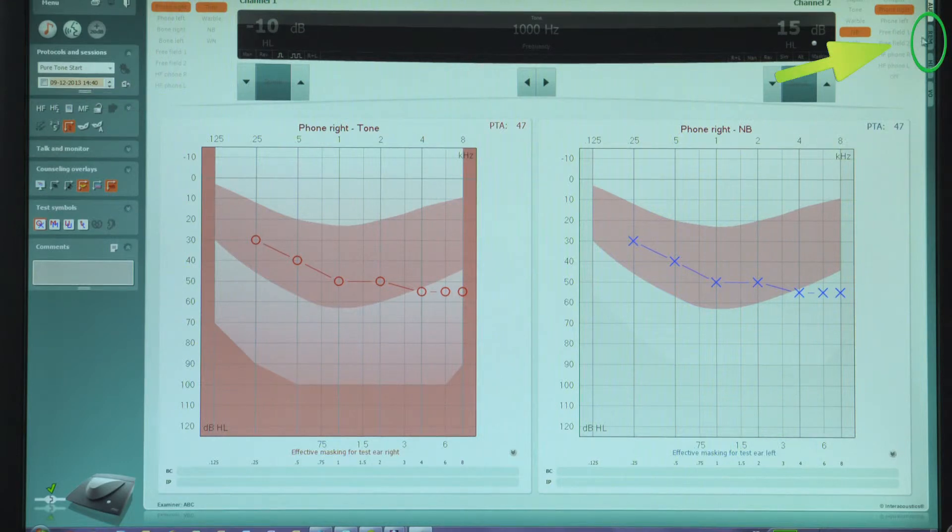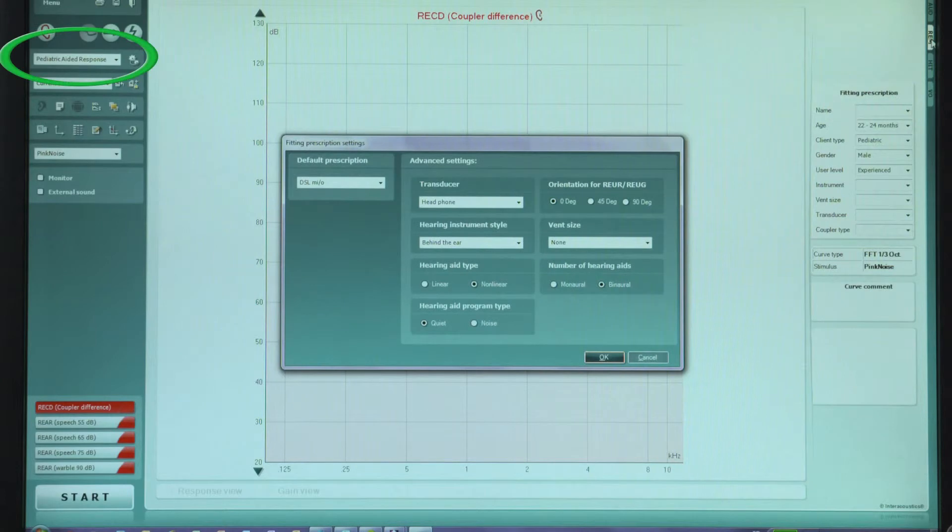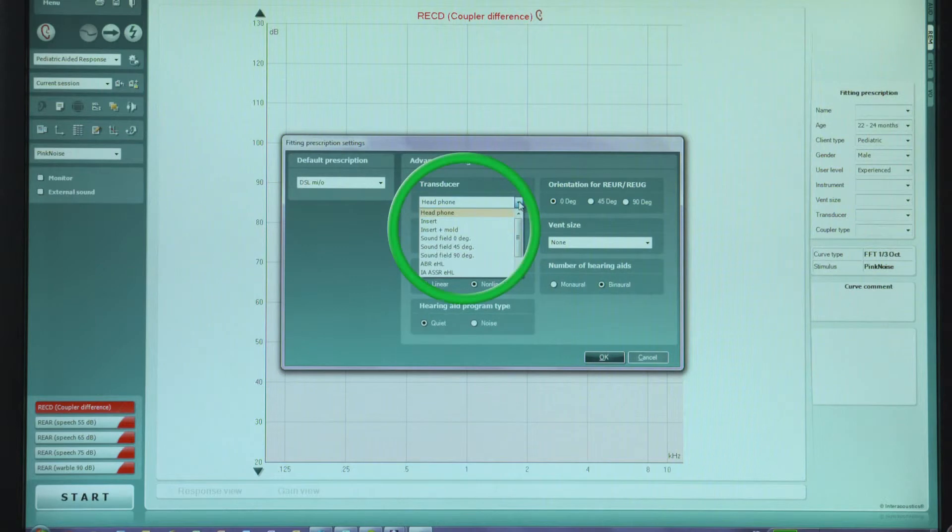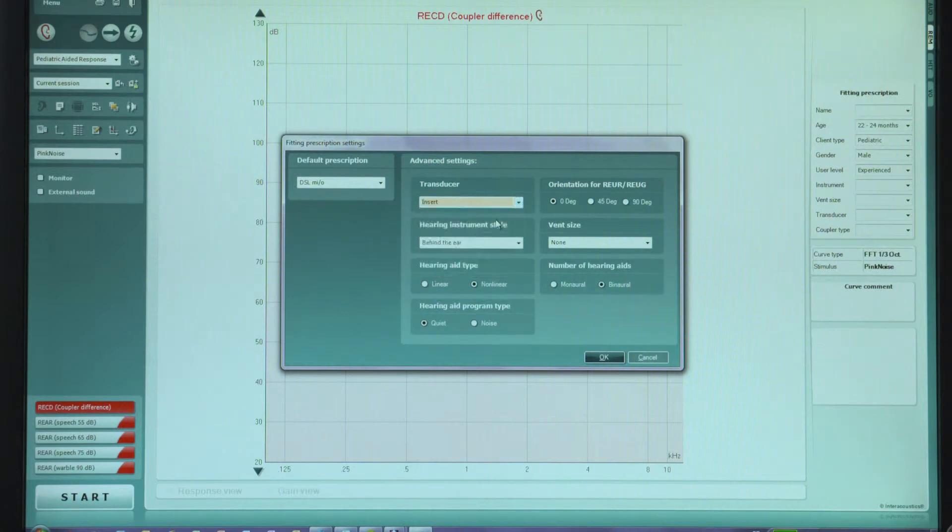Click on the REM tab to go to the Real Ear Measurement screen and select the Pediatric Aided Response protocol. Choose the appropriate settings in the fitting prescription pop-up window when it appears. Ensure that the correct transducers are selected.